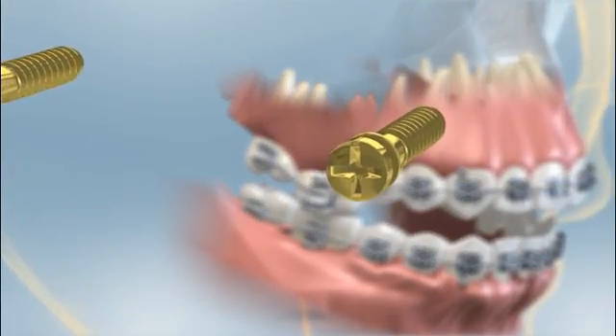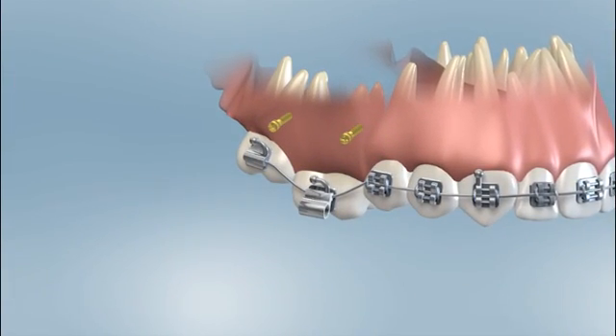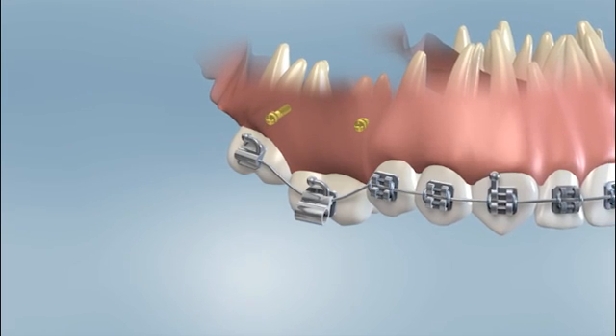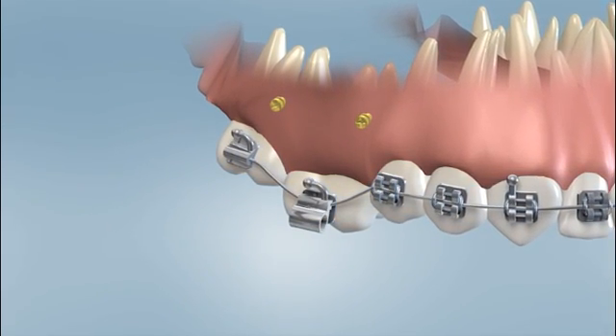A TAD is an acronym that stands for Temporary Anchorage Device. These are little metal pieces that, after they're placed, look similar to an earring stud. They are temporary, miniature surgical screws that are placed through the gums and into the jawbone. This is a relatively minor procedure. Once placed, they become anchored in position and usually will not move until physically removed by the doctor.